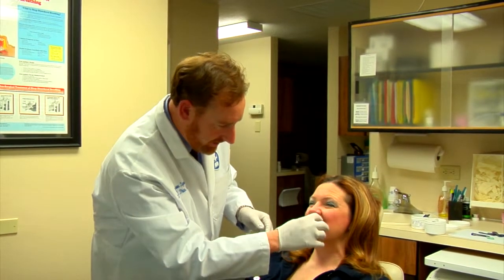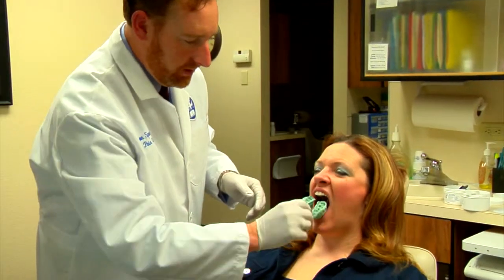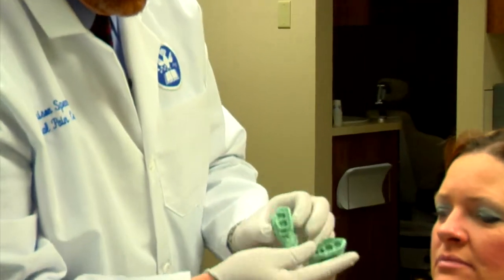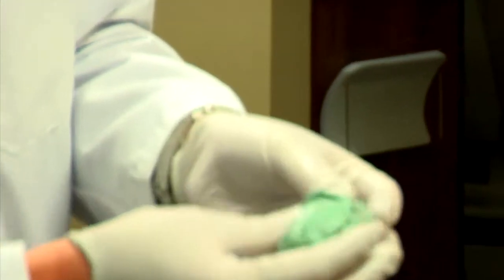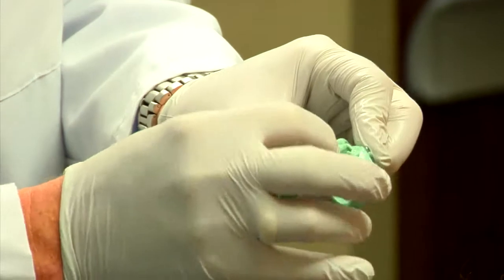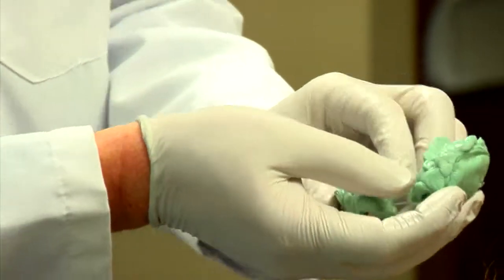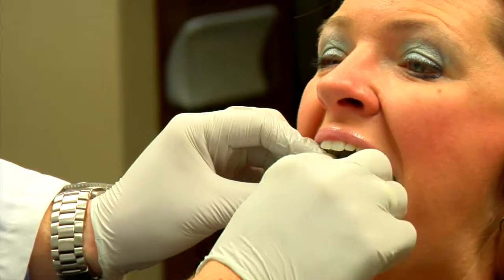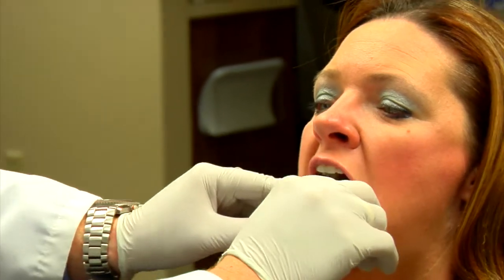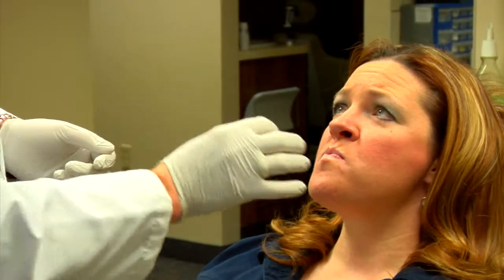Okay, let's take a peek. All right, open for me. Okay, and you see now when she opened, that comes off the bottom teeth, and you can see the definition here on the top. Again, that is very retentive at this point. That material is bonded to the underneath material. It's not coming off. There's really nothing, again, to trim on that, so I would just pop that back in now and close. Okay, bites right into it. Feel around with your tongue, your cheek, your lips, see if there's any place rough or pokey. Does that feel okay?